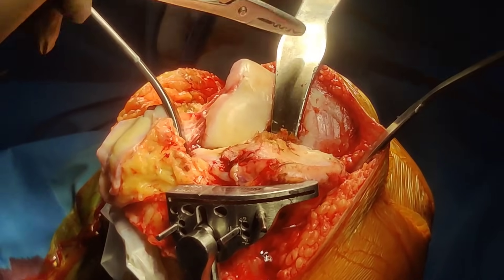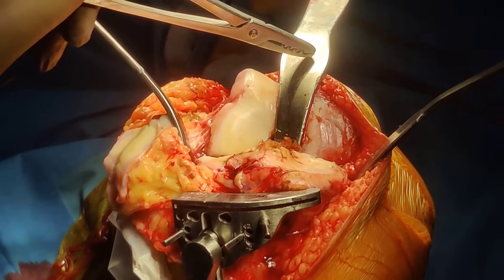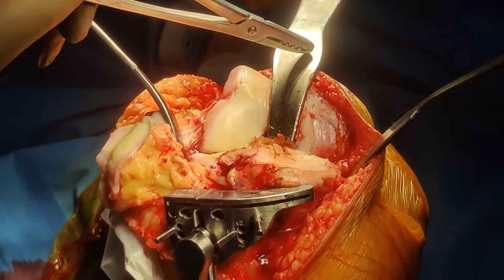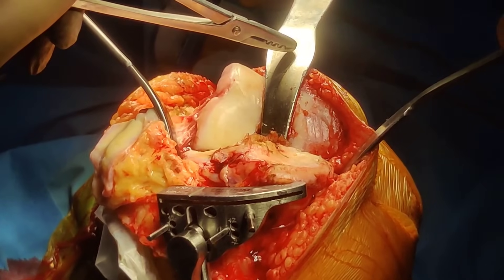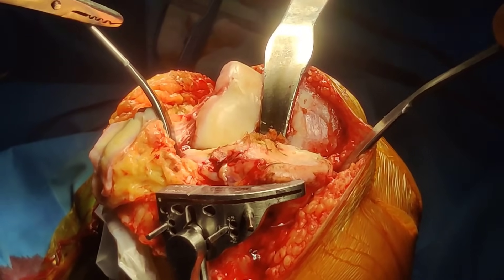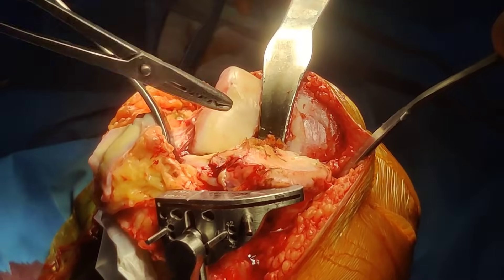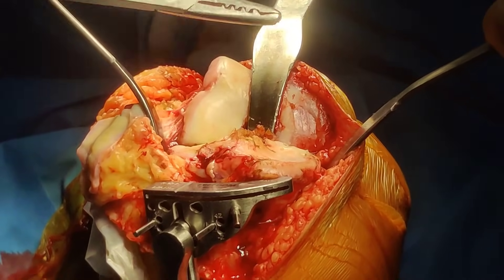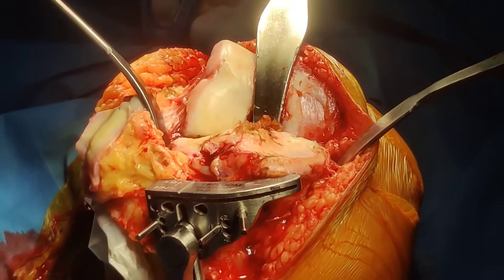This retractor is protecting your medico-legal registration — because if you cut the artery or cut the nerve, you will lose your medical registration. The third retractor is protecting the lateral structure, usually the lateral collateral ligament. You need to see this beautifully, especially if you are doing a posterior stabilized knee — you will have this view most times.